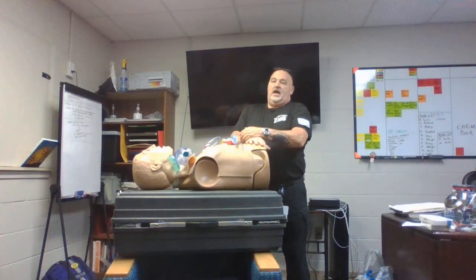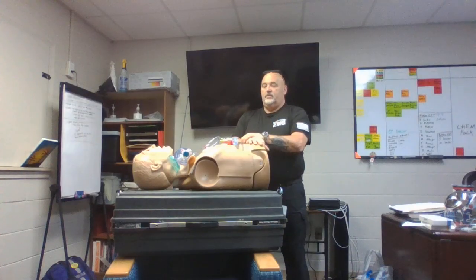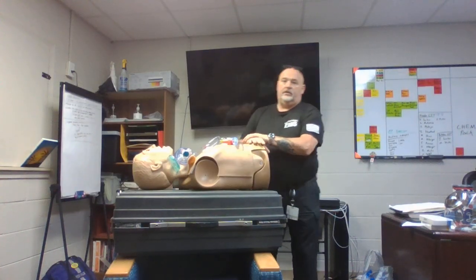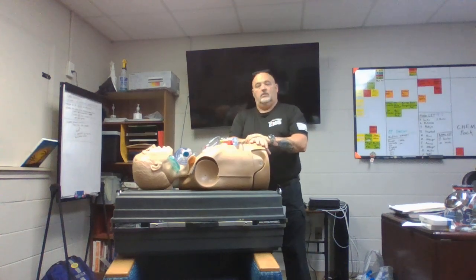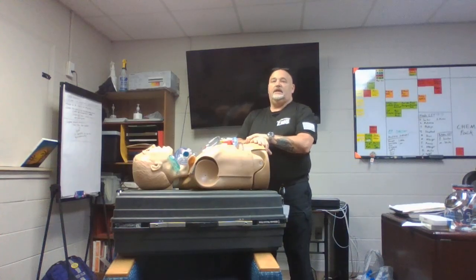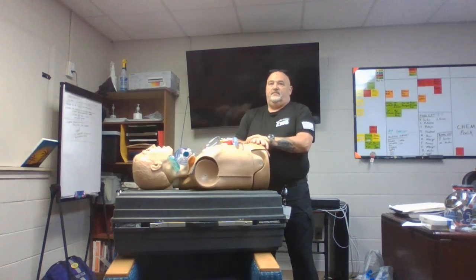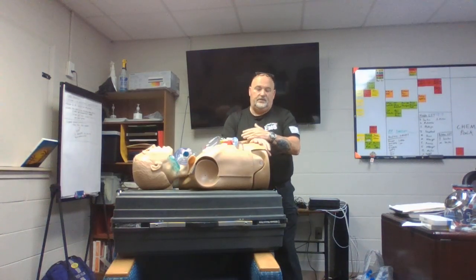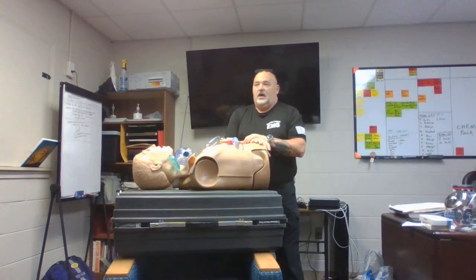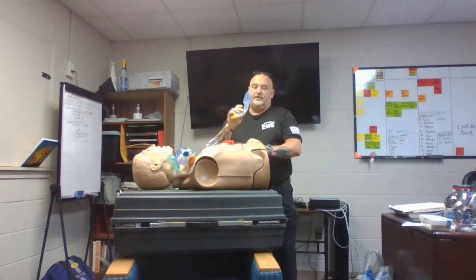Do we walk in on every patient and say, oh, I'm going to have to bag them? No. Do we go in on every single patient and say, oh, you need an NPA or an OPA? No, we don't. Because a lot of patients have patent airways that they can maintain. When we're using the adjuncts and the BIADs, we are doing something to help them maintain that patent airway. And these are somewhat invasive, but not too invasive, until you get to this.